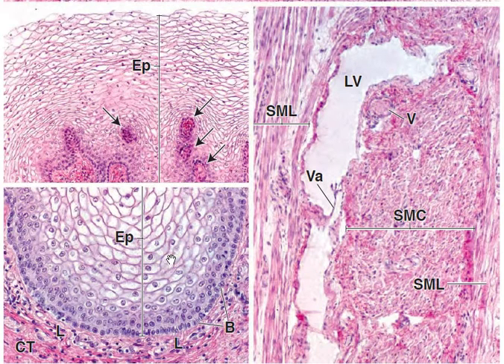The highly cellular connective tissue immediately beneath the basal layer of the epithelium typically contains many lymphocytes. Hey, lymphocytes. The number of lymphocytes varies with the stage of the ovarian cycle. Lymphocytes invade the epithelium around the time of menstruation and appear among the epithelial cells in vaginal smears. So that makes sense, right?